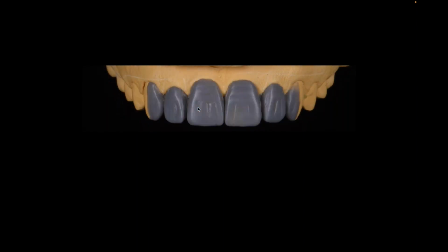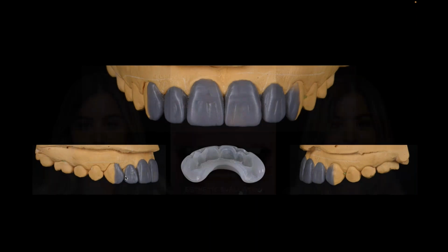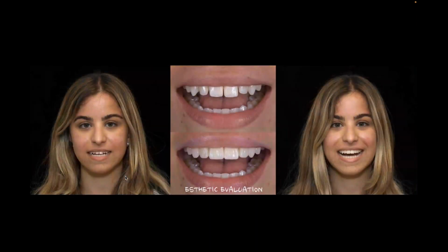So I'll do my diagnostic wax up like we normally would. We just did a modified wax up on the cuspid, or an additive wax up for a window veneer. We'll make our standard tray for that, and we'll deliver that wax up to the patient. And we'll evaluate, did I get my incisal edge position right? I think it looks pretty good in her face, actually. I like it. Maybe I'm a little too square on my design here, but I can modify that a little bit more as we go on.